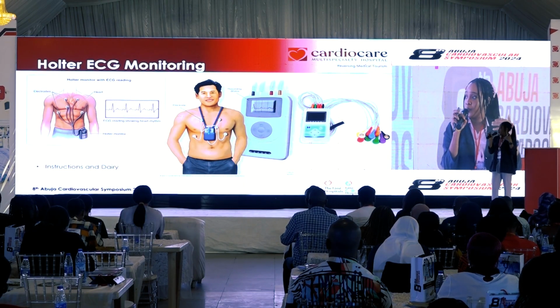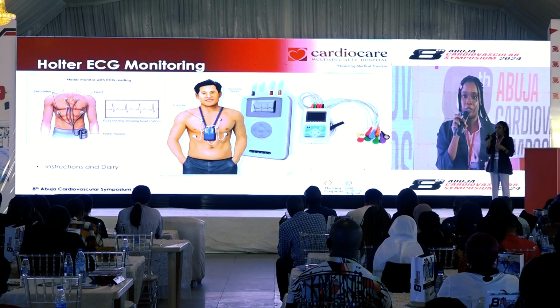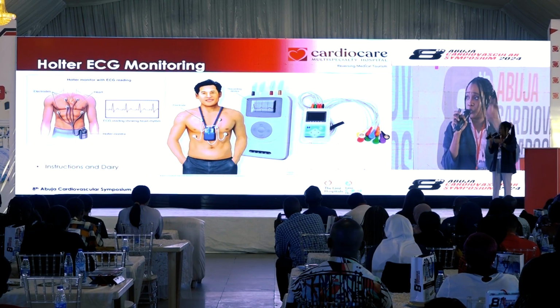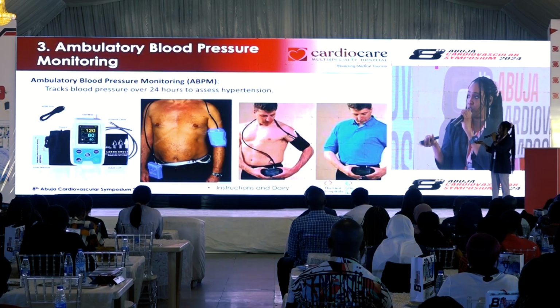Once they go to the house, we can tell them that, oh, you can just remove the bag and keep it beside you, because some people complain that it's very discomforting. You can just imagine having this around your neck for 24 hours. So you could just tell them to remove it and keep it by the side of their bed. And by the time you're back, you bring it back, they download it and they report it.